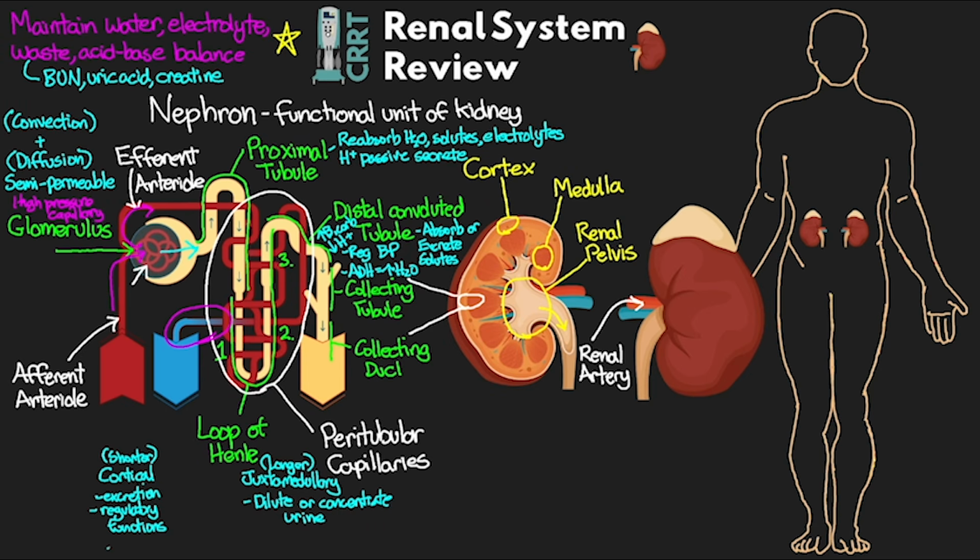And so when our patients go into acute kidney injury and ultimately renal failure, this important regulation really becomes ineffective or non-existent. And in order for us to be able to support these patients, we really need to recreate the work of what's happening inside this nephron. So much of what we attempt to do with the therapies that we offer is based on what the natural nephron is doing. And therefore, having an understanding of what normally happens in here is going to be important to understand the how and why the therapy that we provide does what it does.